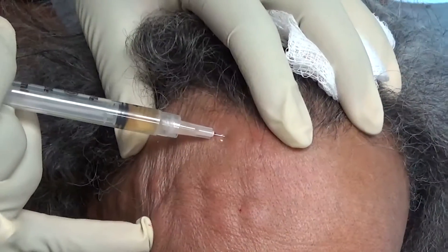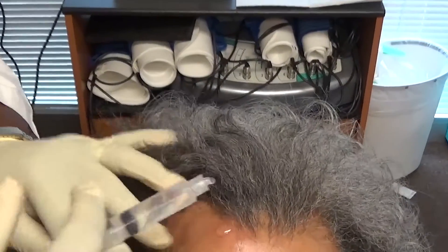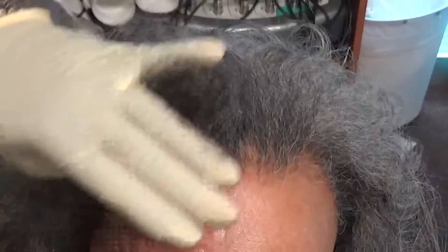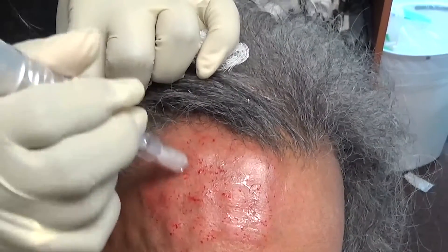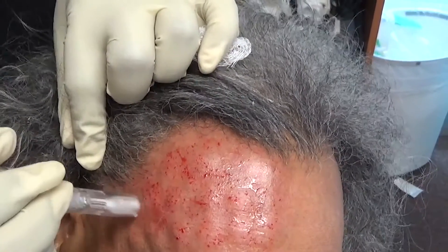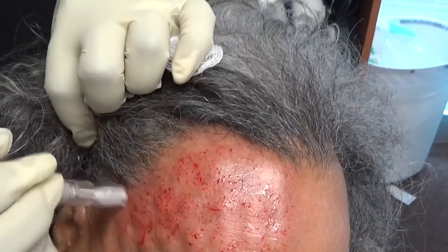We put one more right here and now we're completely done with the injections. We're going to apply the amnion to the surface. You can see it's watery but more viscous and has a really slippery feel to it. When you put it on it kind of feels greasy but it's not. With the amnio it really goes on well because it is slippery — it glides really well and goes very quickly.